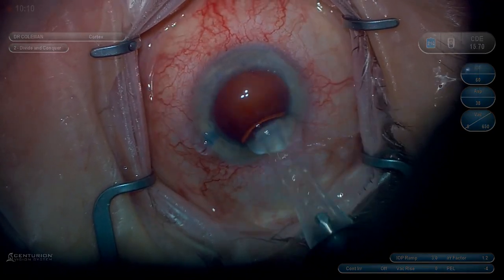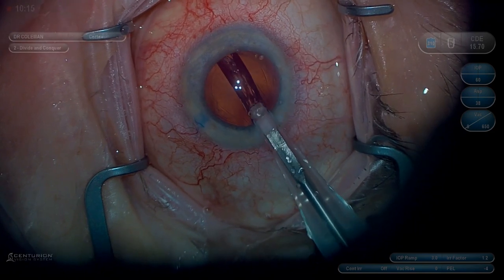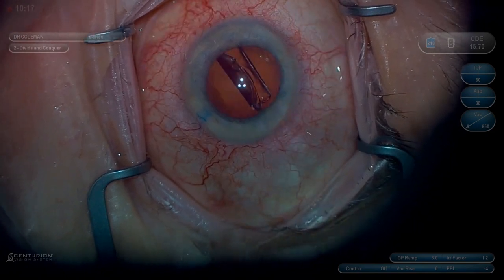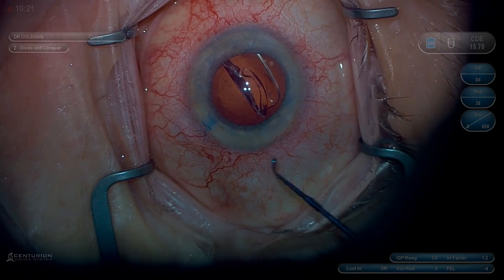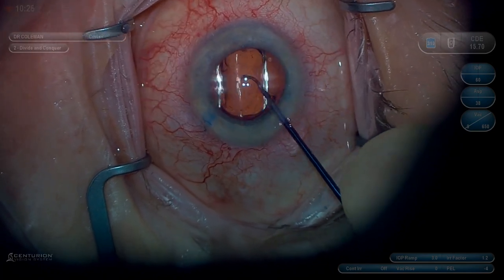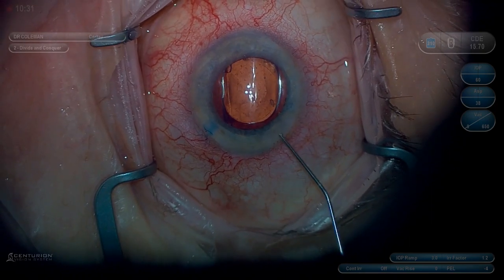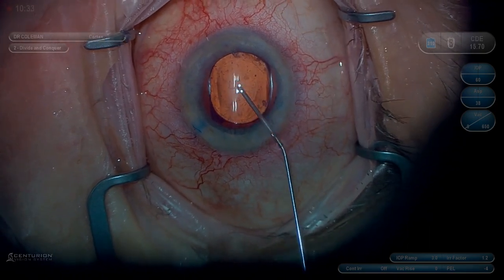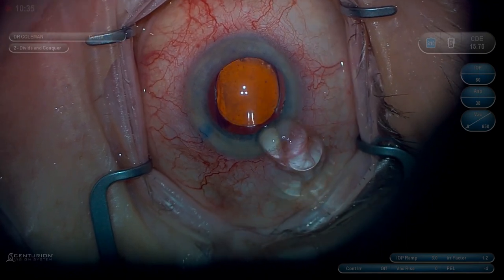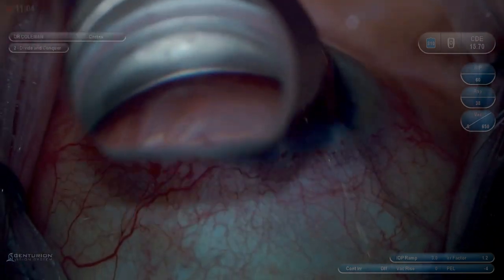Now that the lens is inserted we'll place it in the bag and get ready for intraoperative gonioscopy. We'll fill the anterior chamber with more ProVis to try to open up the space at the anterior chamber angle. Get good visualization with the gonio prism. I love the Ngenuity particularly for these cases because visualization of the anterior chamber angle is basically unparalleled — I've never gotten a better view than I do with the Ngenuity.